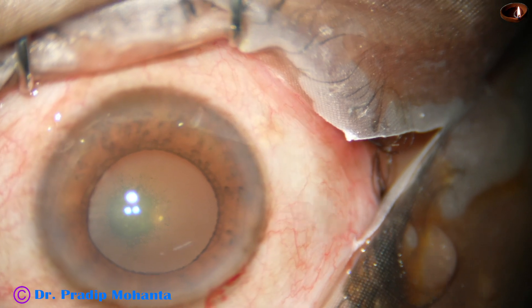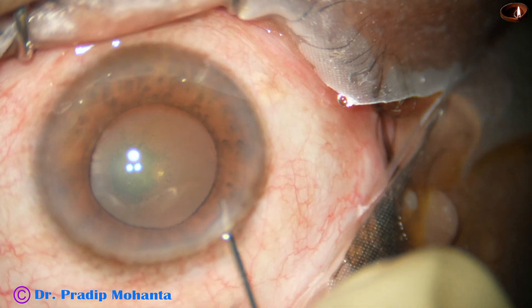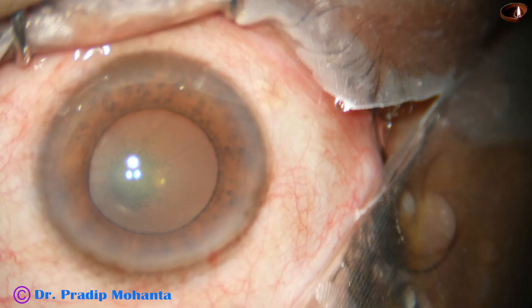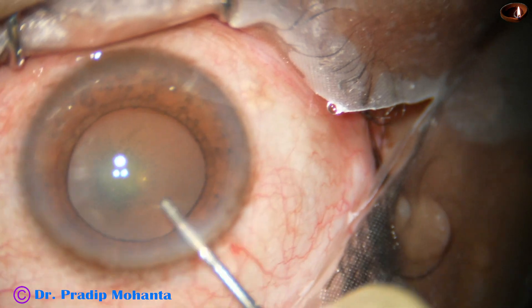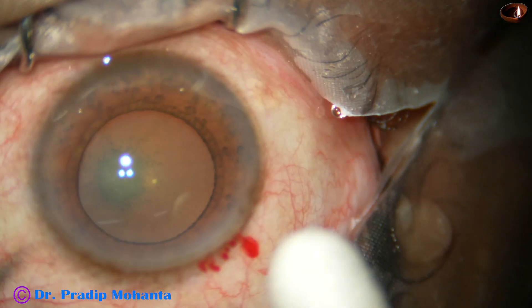Now, a bit of adrenaline is being administered intracamerally. We can see that the pupil is dilating a bit more. The size of the pupil was about 5 millimeters and now it is about 5.5 to 5.75 millimeters.